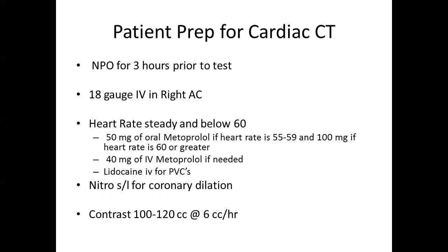If somebody's having a lot of PVCs, we can use lidocaine. I haven't seen it really work that well. So usually with PVCs, it just doesn't work. We give nitroglycerin, and I told you how much contrast we give.